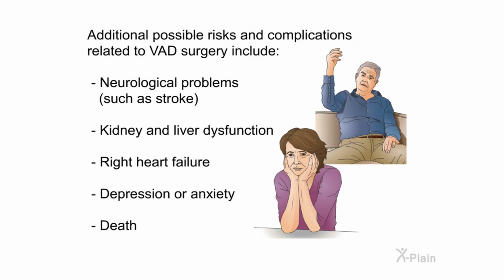Additional possible risks and complications related to VAD surgery include neurological problems, such as stroke, kidney and liver dysfunction, right heart failure, depression or anxiety, death.